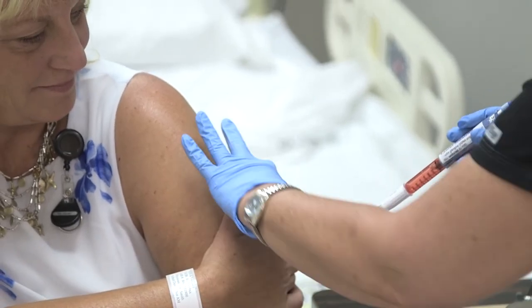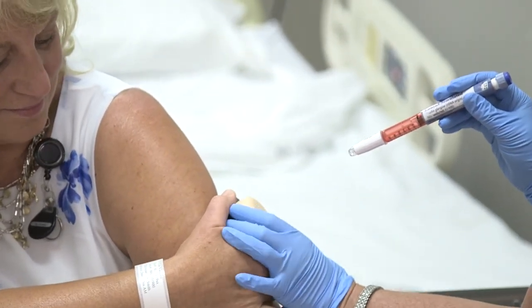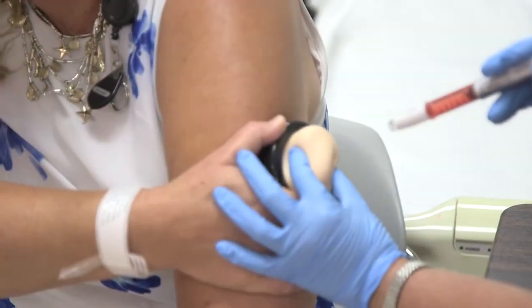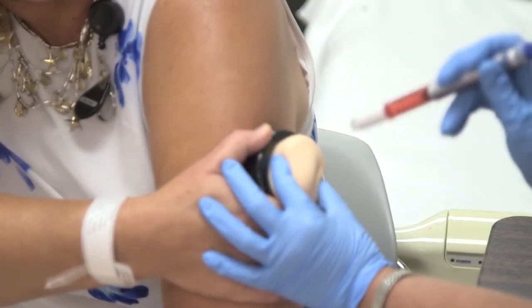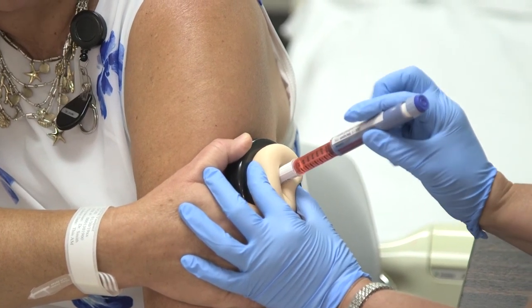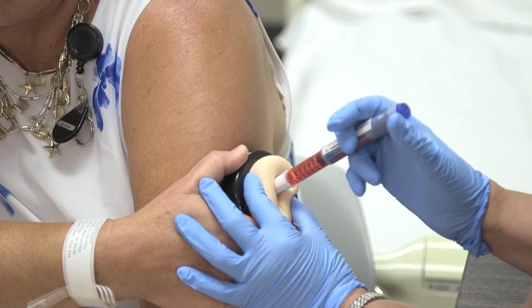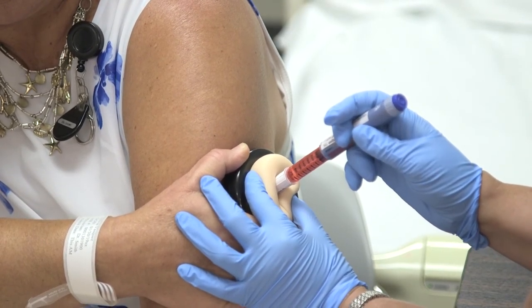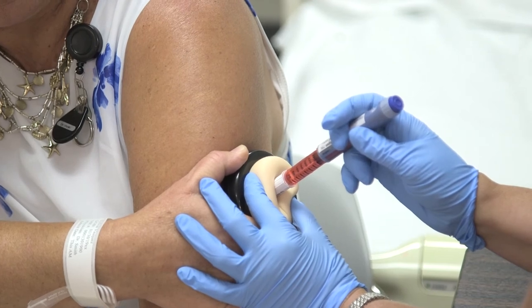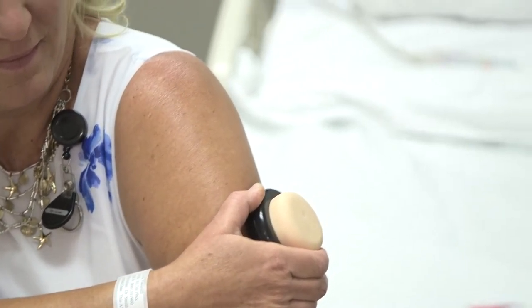I've cleaned the area and I'm going to pinch the skin. I push the pen in — I heard the click, so I'm ready to inject. Keep squeezing. I've pushed it in and will hold it: one, two, three... seven, eight, nine, ten. Then I let go and pull out the pen. We've successfully injected with the insulin pen.